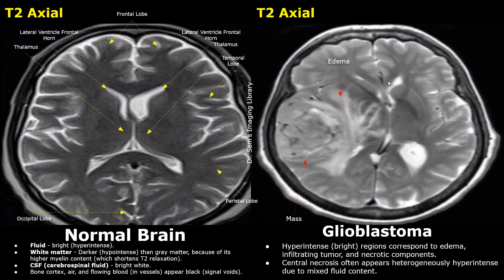This mass is less hyper-intense than the previous cases. It has some bright areas but is mostly heterogeneous. For these types of masses, evaluation in T1 contrast sequence will show peripheral enhancement with a hypo-intense central core. These findings help greatly in diagnosis. Ultimately, a correct diagnosis is done after evaluating all relevant sequences.